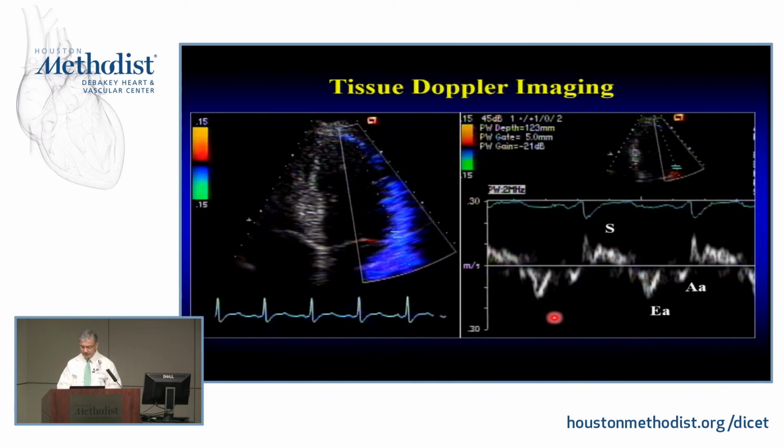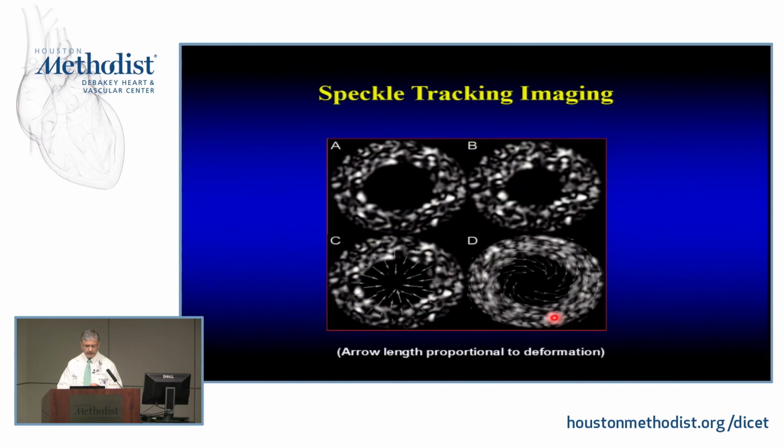Now, pulse Doppler is important, and all the work on systolic function and diastolic function. We were reminiscing yesterday about Dr. Nagueh's contribution 20 years ago, this E over E prime, which has been in play for 20 years and is used all over the world now.